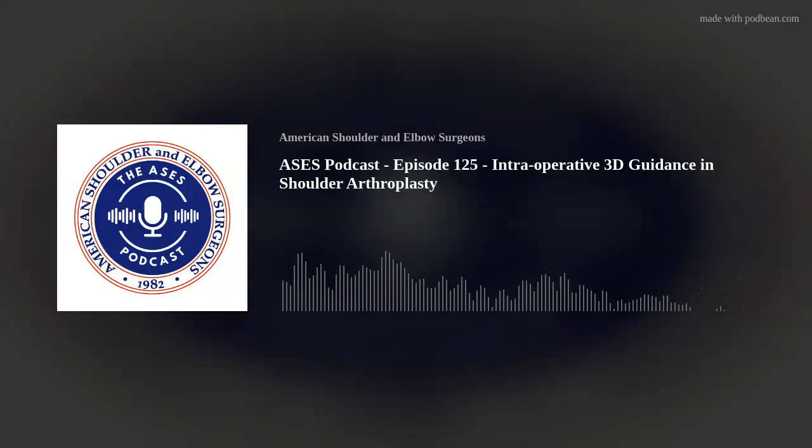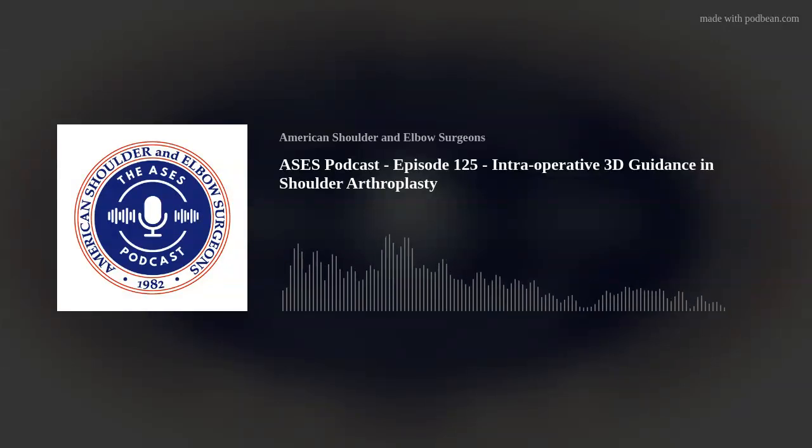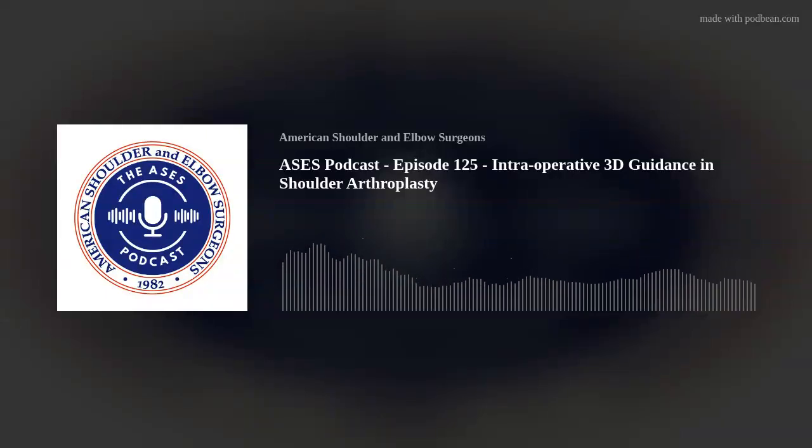minus a few degrees. And then inclination wise, it's between 5 degrees inferior tilt and neutral inclination, based on the patient's anatomy. Thankfully, with the implants we have now, it's pretty easy to execute that without removing too much bone. I want to ask you a question.